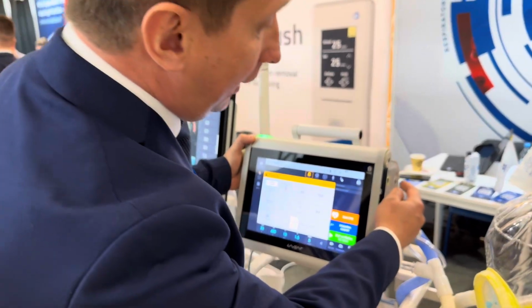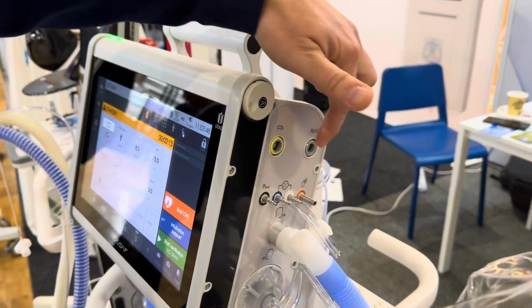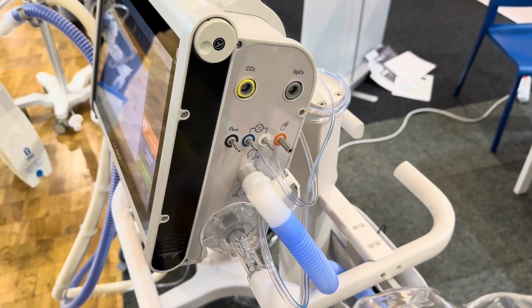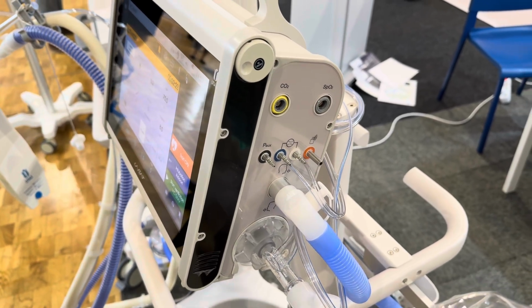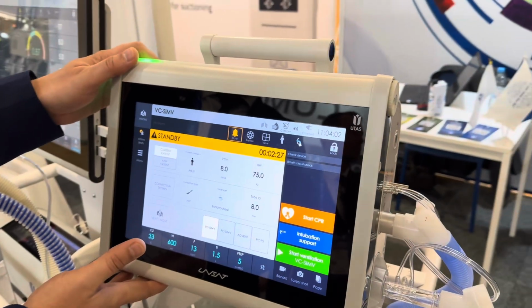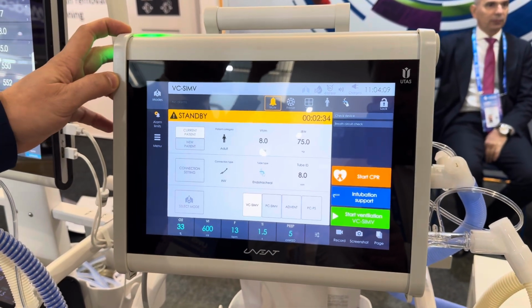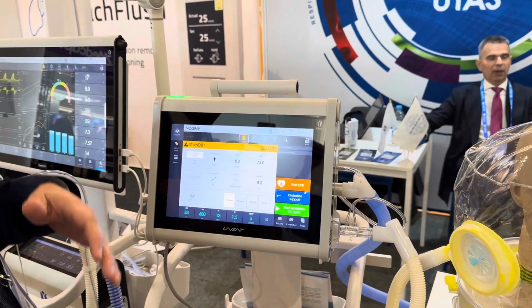The device is equipped in the basic set with the CO2 and SpO2 channels, the pneumatic nebulizer, and also an auxiliary monitoring channel with the balloon catheter, esophageal balloon catheter pressure monitoring, and it has a built-in turbine and ultrasonic oxygen sensor, which is maintenance-free, calibration-free, with lifetime warranty. So to set up the device is very easy as ABC.